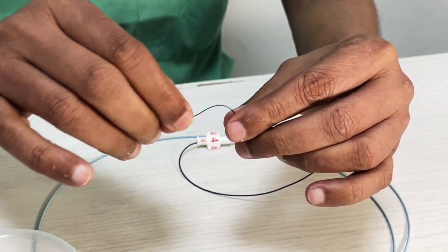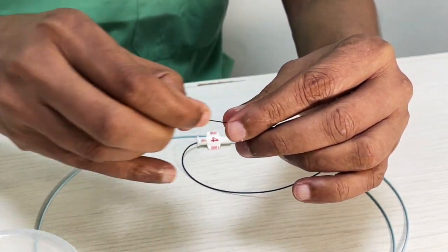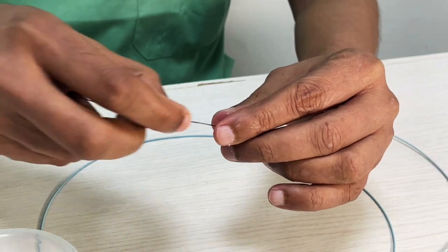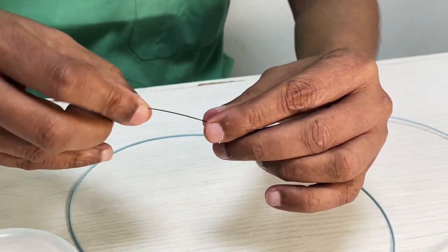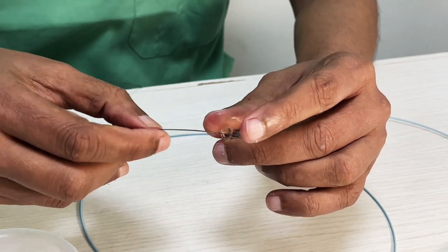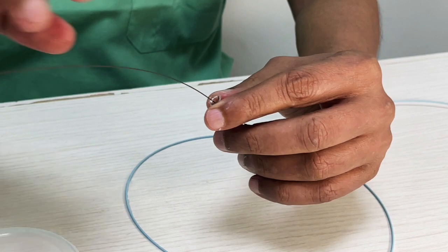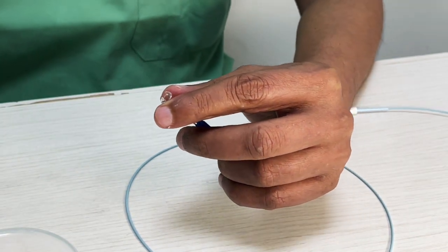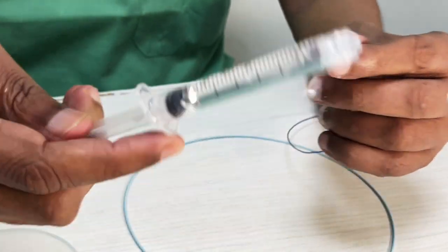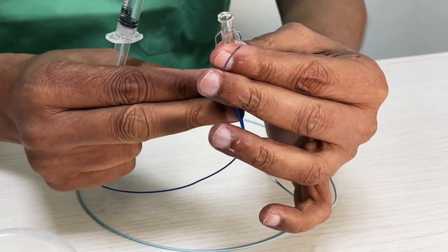It almost works like particles and works very well if you have nothing to worry about distally. One of the things we also do is sometimes we push the first coil with a wire so it forms a basket. Then we know it will be held back, and then we inject. So as I said, you can push it out, but just to show you, it's very easy to inject it out. That's going to come out fast, so keep a close watch. So here it is.